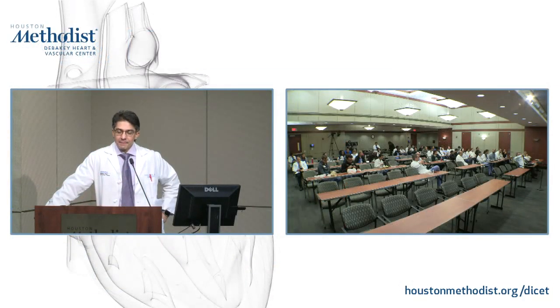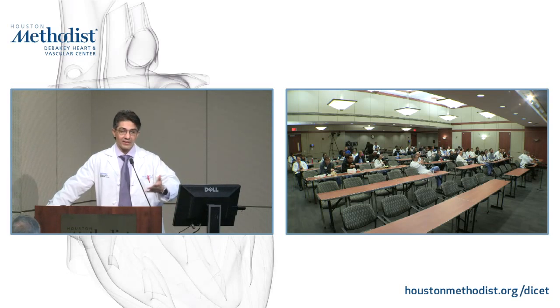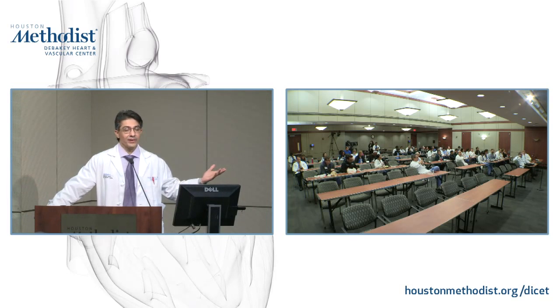So I think the age factor is very important, because you can calculate percentiles to give you a feel for your patient's age. Overall, in general, the overall score is predictive. This patient is at very low risk, but Dr. Q is also right. Obviously, if he's 30 with already showing evidence of disease present, I think we'd all take that patient very differently. The guidelines at least give it, you know, when they consider lipid therapy, percentile greater than 75%. You can consider treatment.